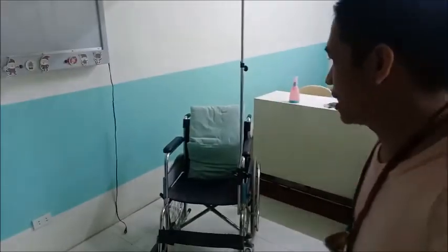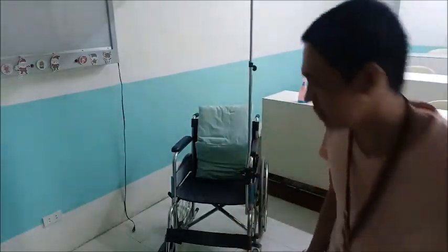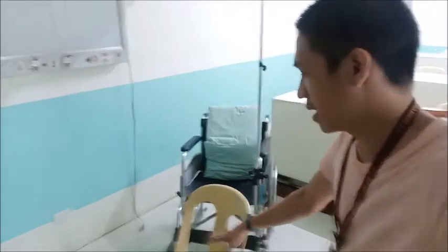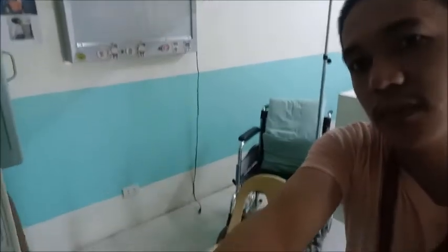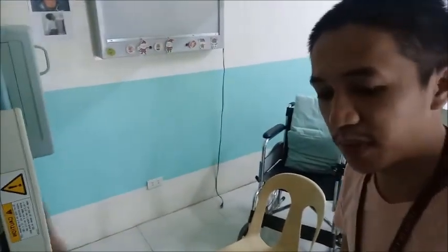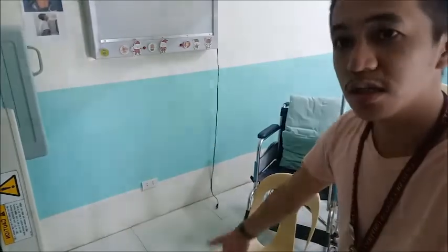If required gyud ang lateral, i-transfer ninyo ang patient to a stool or a chair, for example monoblock. Most common sa hospital ang mga plastic stool. Remember patient care, how to transfer patient from bed or wheelchair to a chair.